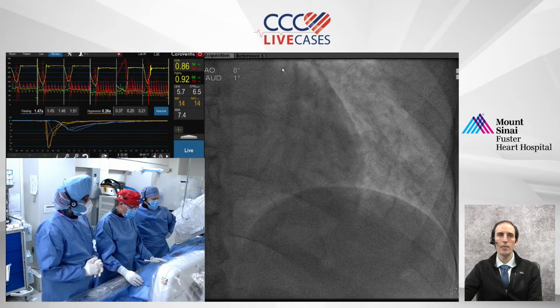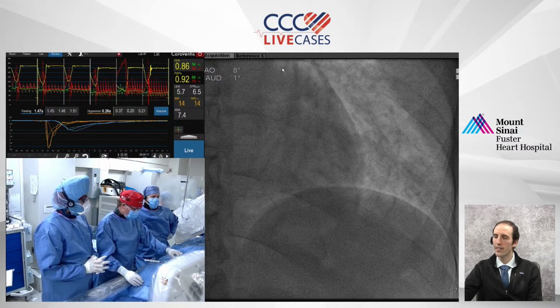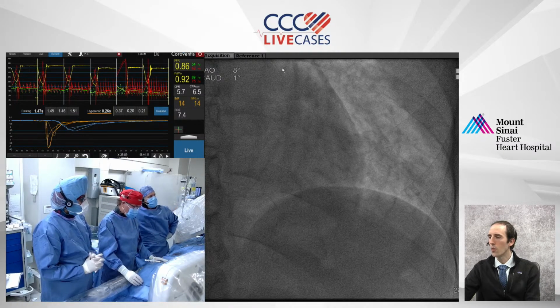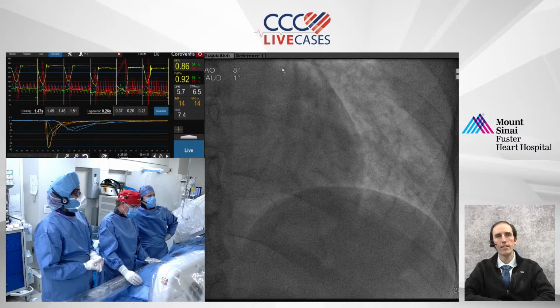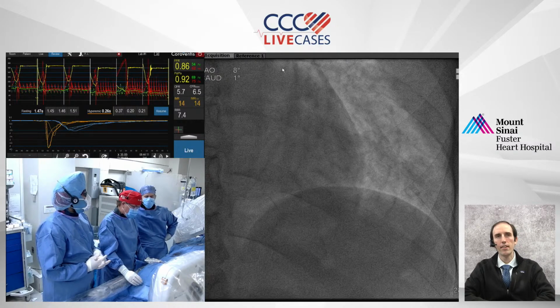So maybe bridge length would be bridge depth. Exactly, there's a lot there. Exactly, but I don't see any angiographic evidence of a bridge here, so I don't think imaging her is going to provide any further information.